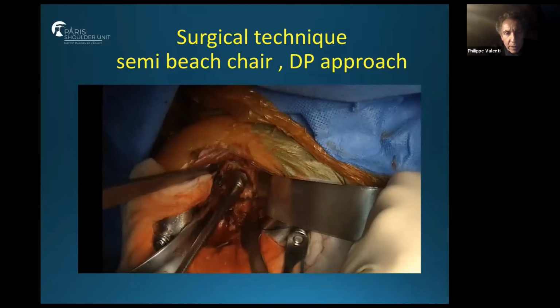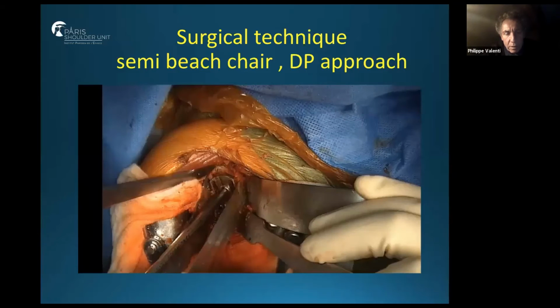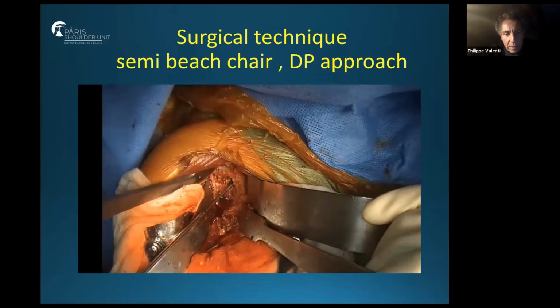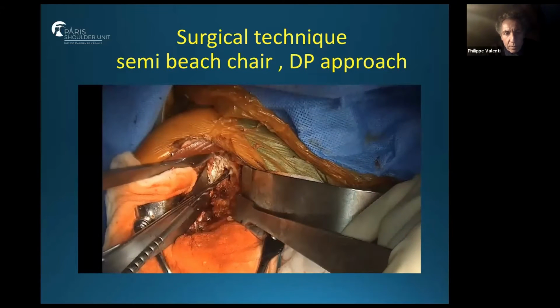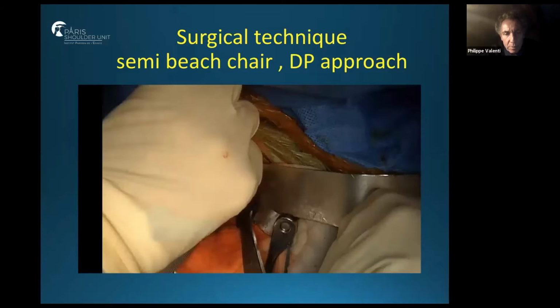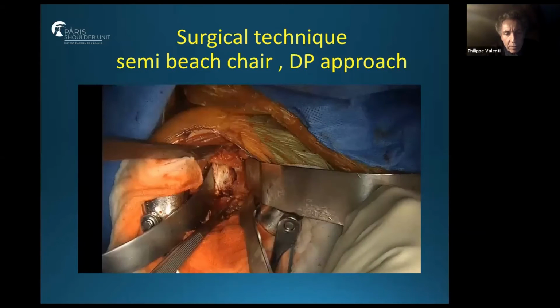After you prepare the keel, you have a space superiorly, and you have to put the cancellous bone graft between the glenoid and the back of the base plate. I make small holes to increase the potential fixation of the base plate. I put the cancellous bone graft superiorly, taken from the head. You see that you have a bone graft.